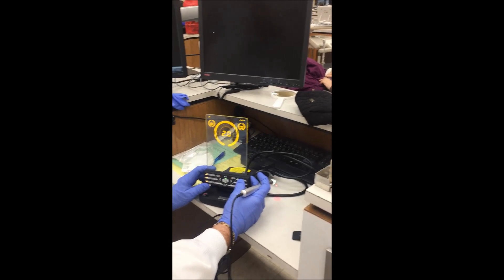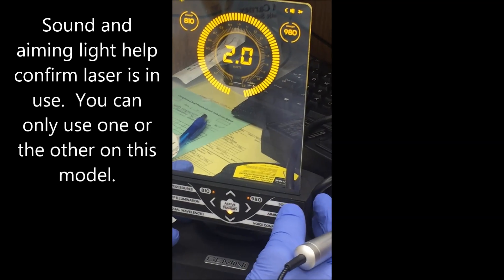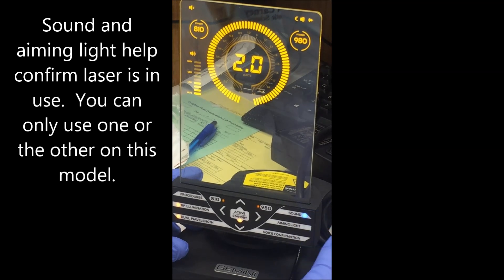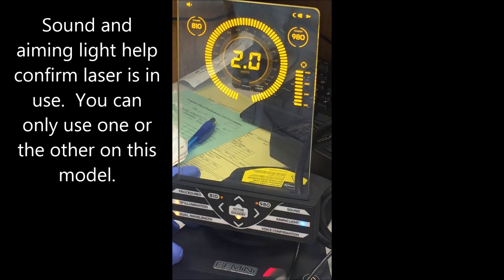We're going to activate the sound and the aiming light. Evidently you can only have one at a time, so we're going to go with the aiming light.